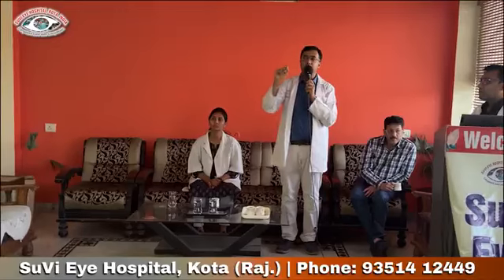For focal laser, in case of CSR, or in case of non-center involving diabetic retinopathy like circinate retinopathy with microaneurysms, we use focal laser to blanch the microaneurysm. In order to titrate for the focal laser, we first do it in the periphery to see for the just visible burn, and then we blanch the microaneurysm, so that a just visible grade 1 burn is there, because it is very near to the center, so that the patient does not experience any scotoma.